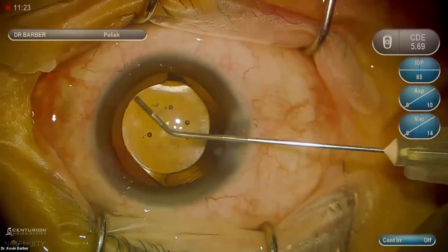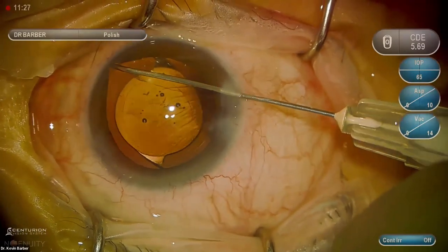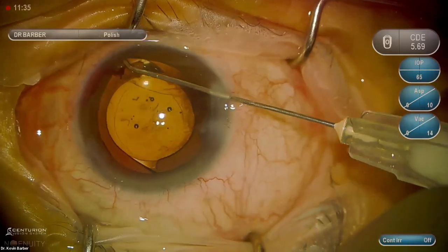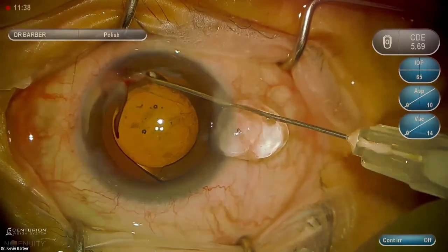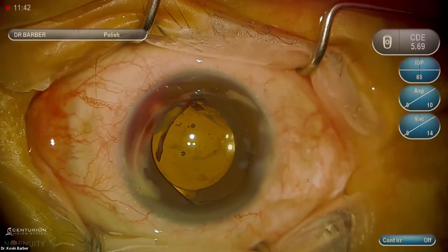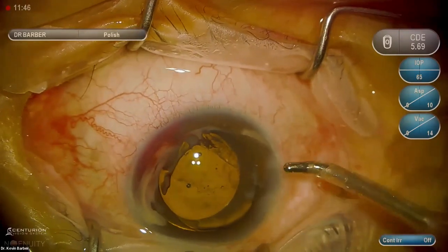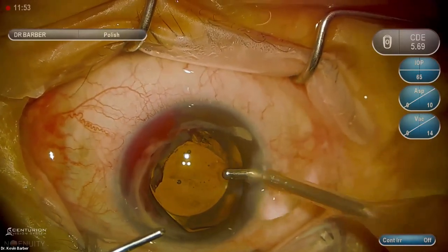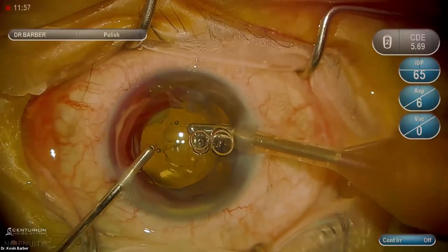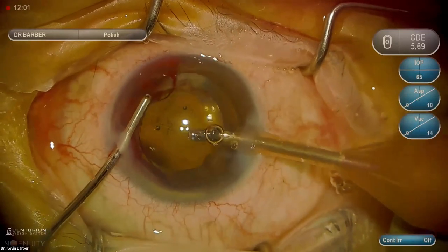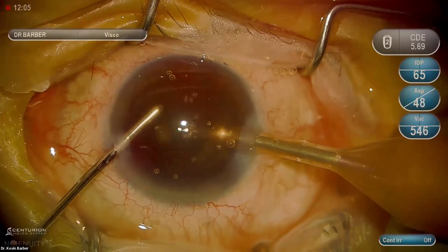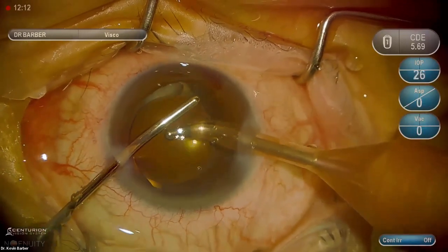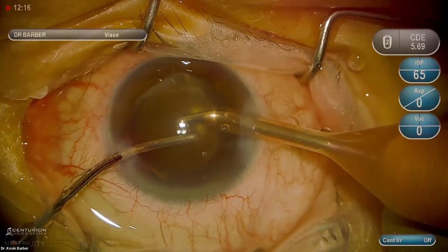This EDOF looks like a monofocal lens — if you catch the reflection, you might see a little raised button in the center of the lens, but that's it. Very different from a multifocal, which is why there's much less visual disturbance with this lens. Regarding IOL haptic position — vertically or horizontally — I'm not aware of conclusive evidence that it affects ELP or centration. In this case I'm aligning them vertically because I need to get a piece of cortex and don't want the haptic in the way.